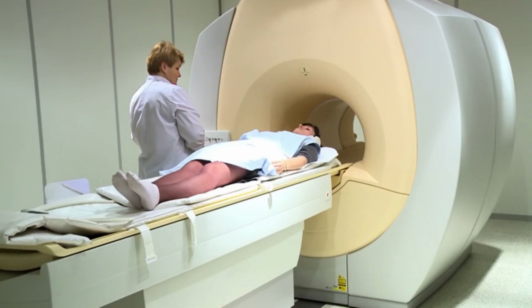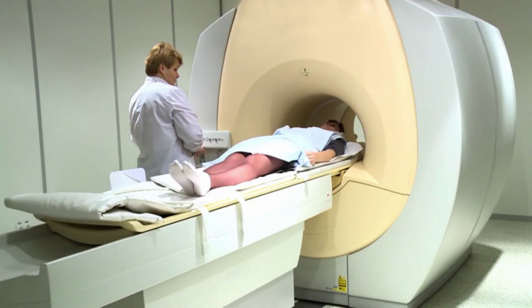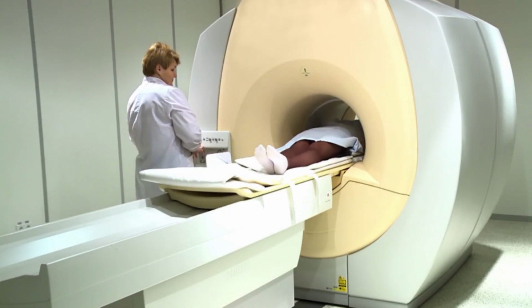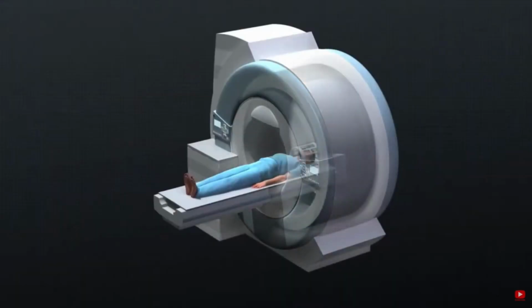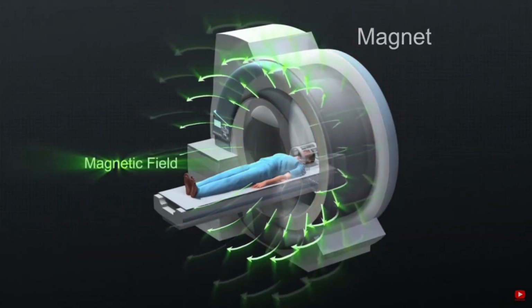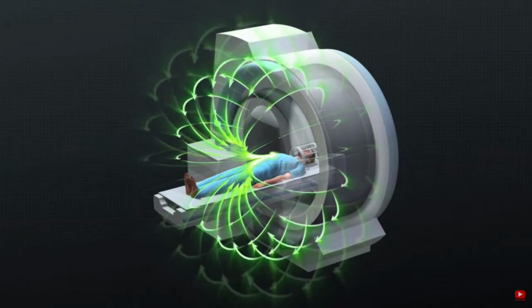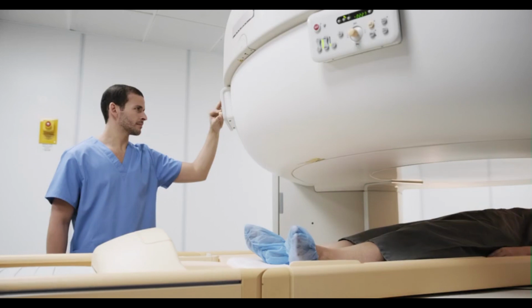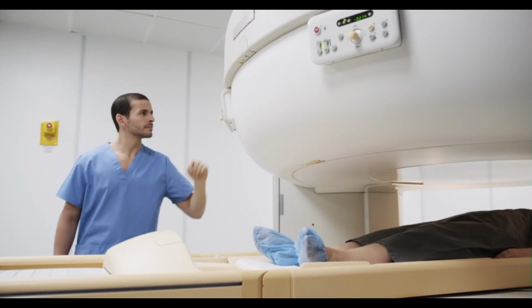An MRI is the abbreviation for magnetic resonance imaging. The machine is similar to a CT scanner in how it looks, but it has a longer tube. Unlike a CT scan, an MRI uses magnets to generate images, so there is no radiation, so it is considered safer than a CT in that regard. MRI machines can image both bones and soft tissue, but they cannot be wheeled around a hospital.